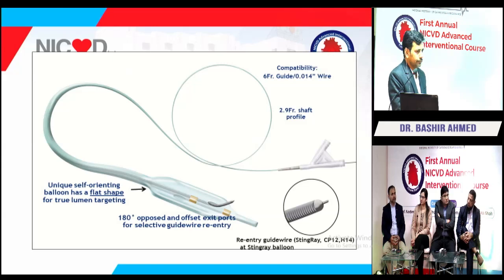The key to Stingray is you only inflate it at 4 atmospheres. So those two cylinders to the side would light up. The middle of the balloon is hollow. That is not a balloon. Only the side ports are. So you can think of the artery, it just sits flat with two portions.